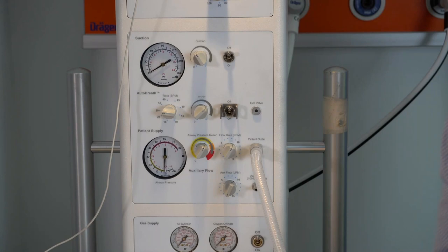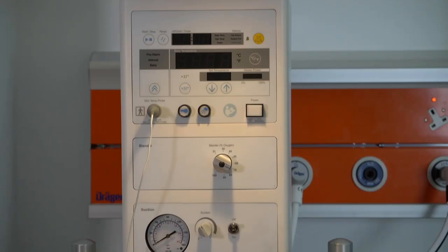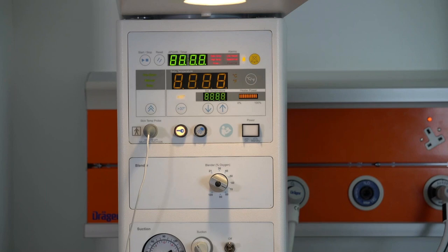So we use the power button. Let's go up and see. So we turn on by using the power button, and the device is going through a really quick self-check. This self-check includes the check of all the electronic mechanisms in the device to say that it's functional, that it's working. So now we also see the strange letters, PRE. What does it mean? It means that we are currently in the pre-warming mode.